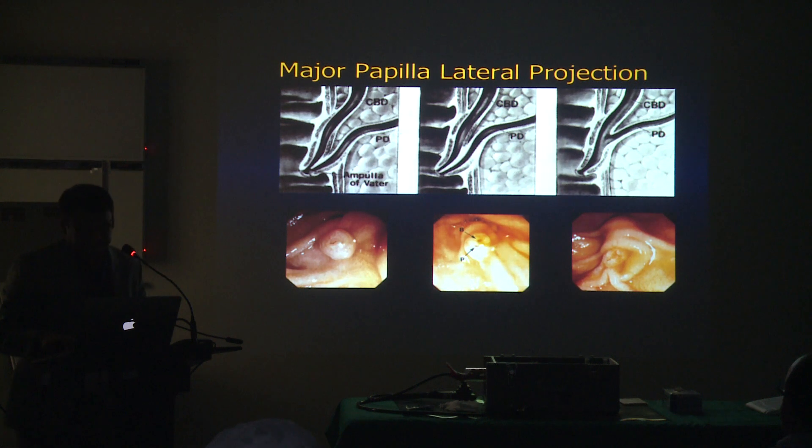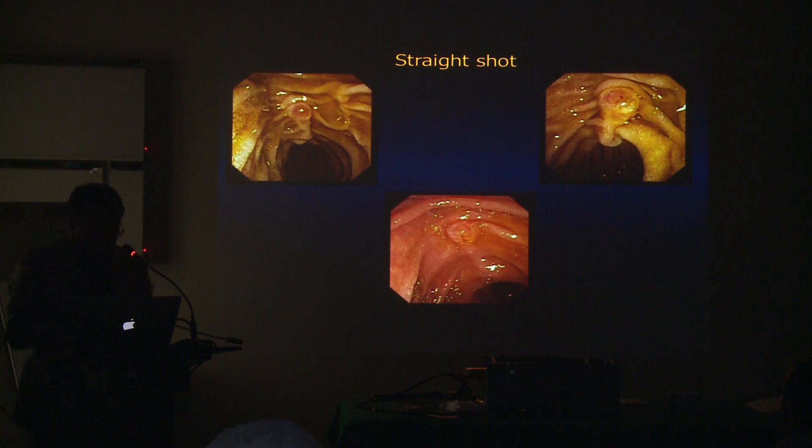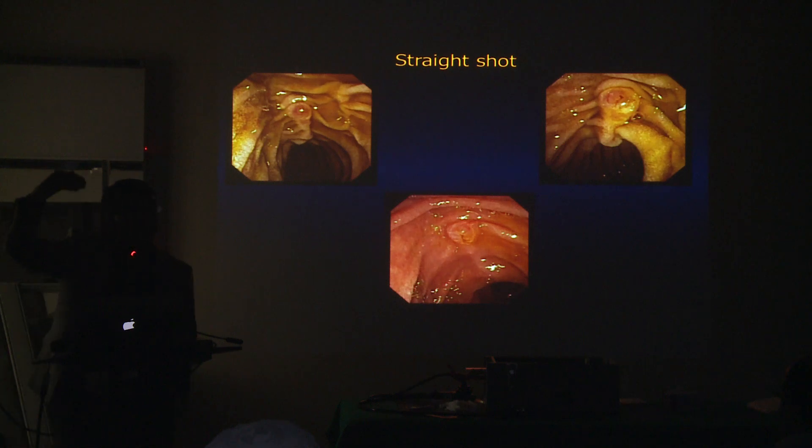These are nice papillas. This is a kind of flat papilla — flat papillas are really the easiest ones to cannulate, those really adhered to the wall. Those are straightforward, usually not a big problem. If you touch the right place, it should be easy.